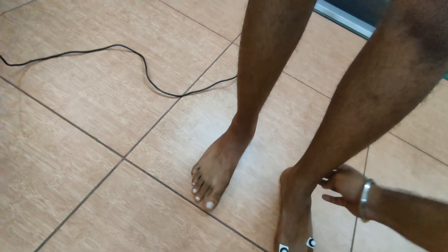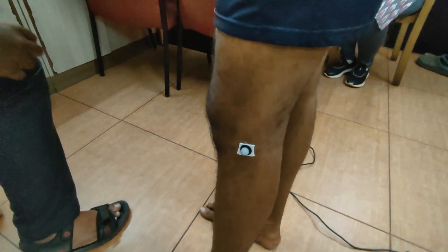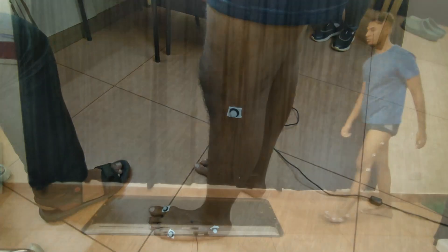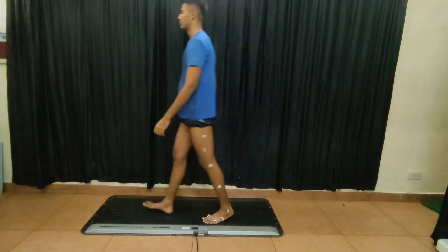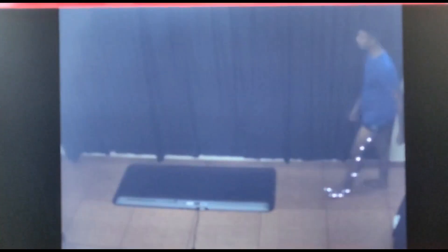For movement analysis we start with the markers — we put markers on the body. These markers are detected by the camera and on the software of the computer. They are placed on certain points like the knee joint, first metatarsal, fifth metatarsal, and lateral malleolus. With the markers, the person has to walk on the force plate and the video is taken of the same.